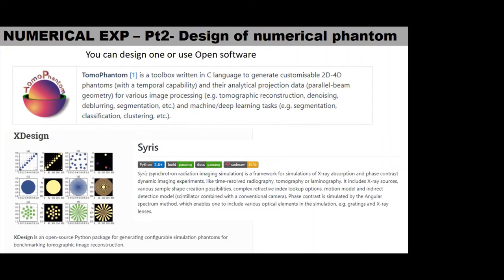I have a question, please. I missed an important detail in the paper about the phantom. I wanted to ask you, they only labeled the tissues by characters, tissue 1, tissue 2, to tissue 9. Even though they give the atomic number, they didn't tell us the specific tissues that the phantoms represented or simulated. I was just wondering why the detail was missed in the paper. Perhaps this was a limitation. I wanted to get your thoughts on this.